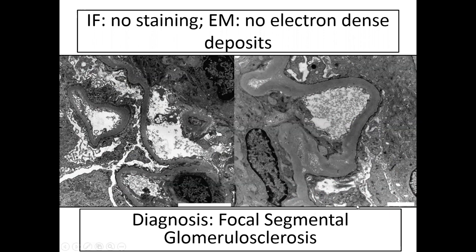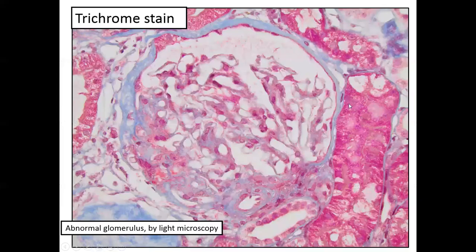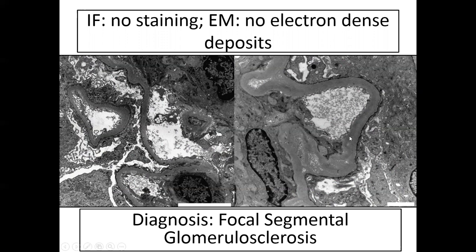So I can tell the clinician, the reason your dog has proteinuria is your podocytes are injured. I don't know exactly what caused the podocyte injury, but I can definitively tell you it wasn't immune complexes. So this is a non-immune complex mediated disease. Immunosuppression is not warranted. It would not help the patient. So this is a situation where we really had to, based on this, say, I see a lesion, I see tiny irregularities in the glomerular basement membrane. This is probably an area that was a thickened capillary wall to match my thickened capillary wall out here. But I don't know why.